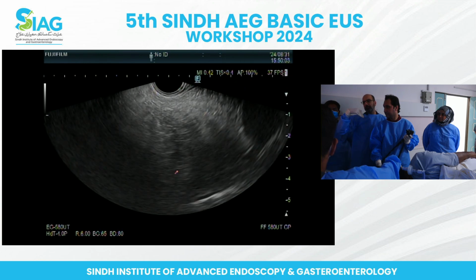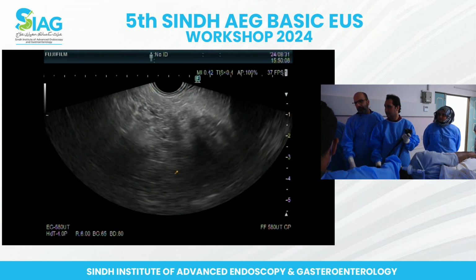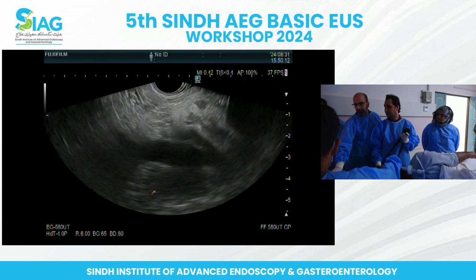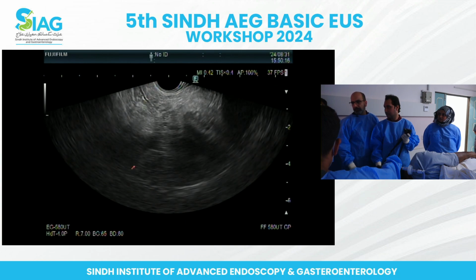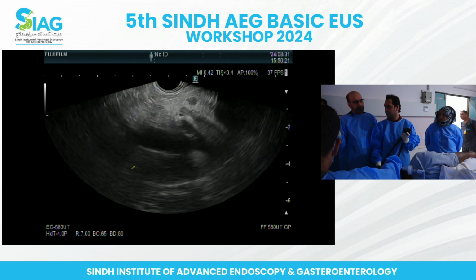Okay, so that's basically your pancreatic duct evaluation. Go clockwise for a second, just to make sure we're not looking at it. Yeah, that's going to be the SMV, so the PD is actually going to follow down this way too. So that's pretty much it from here.